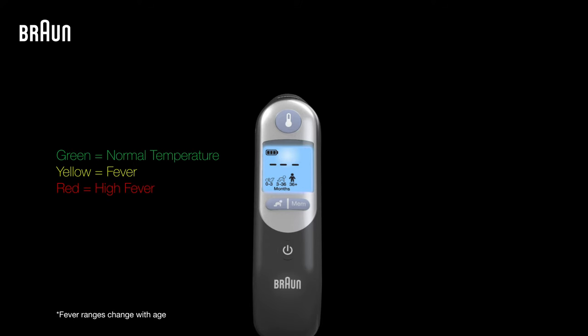The fever guidance system will change the display to either green, yellow, or red, depending on the temperature reading of the age group selected.